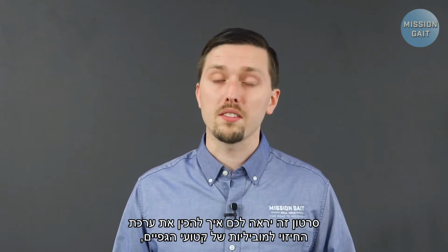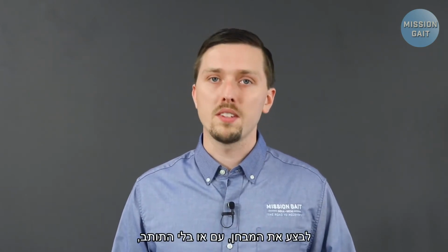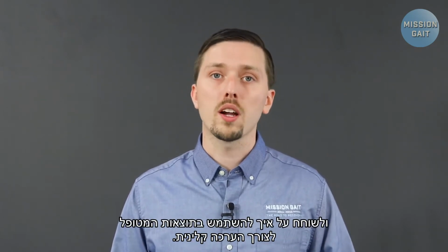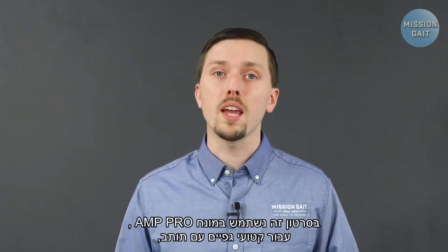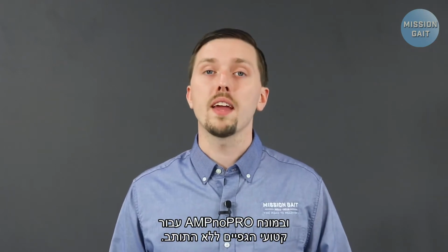This video will show you how to set up the Amputee Mobility Predictor, or AMP for short, perform the test with or without a prosthetic limb, and discuss how a patient's score can be used in a clinical setting. For this video, we'll be using the terms AMPRO for the AMP with a prosthetic limb, and AMP No Pro for the AMP with no prosthesis.